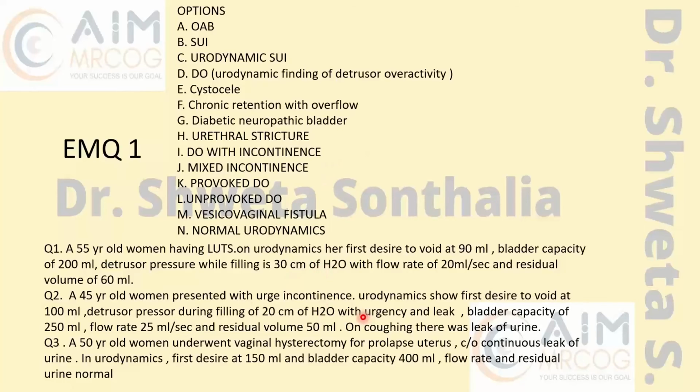My dear, because on coughing there was leak. Overactivity, and one is coughing and leak. As I told you, this is recall. The sentences might not be complete, but they are telling you about detrusor overactivity and leak, and they're telling you about coughing and leak.